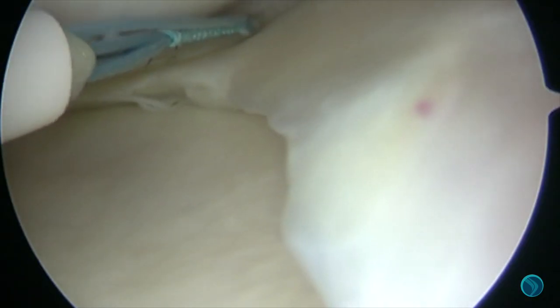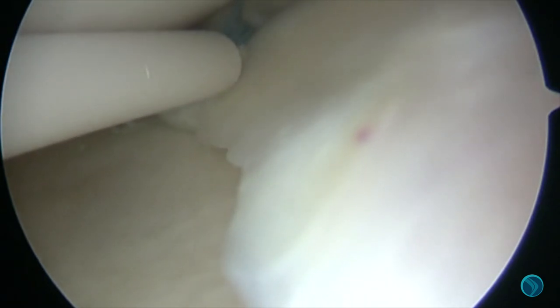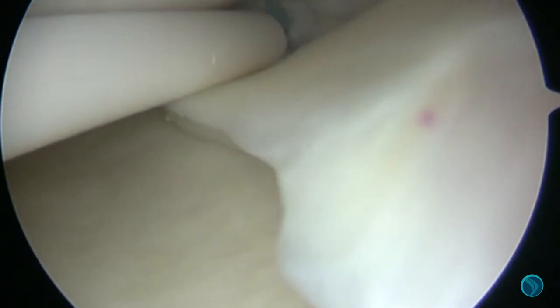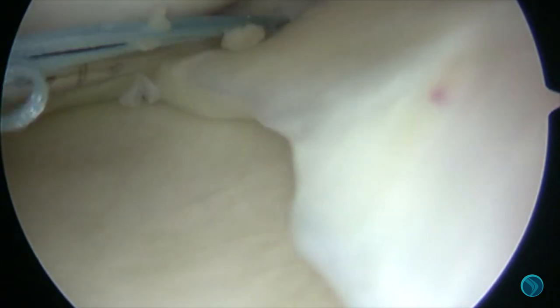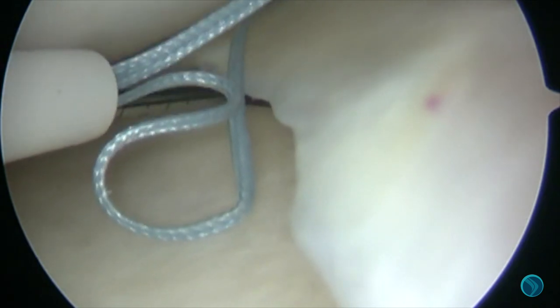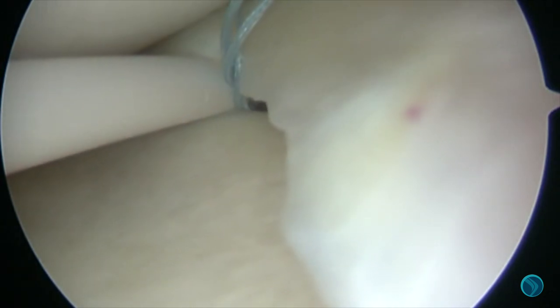Using the first fibre stitch measured to 18, penetrating just above the meniscus into the posterior capsule, feeling it move through the capsule, and then advancing the first suture device. Rotating that wheel backwards then all the way forwards, removing it back into the joint, going underneath the meniscus again making sure we can see where we're going, and penetrating all the way through the capsule to the other side. Again advancing the needle, all the way backwards, all the way forwards until we feel that click, and bringing it out through the joint.